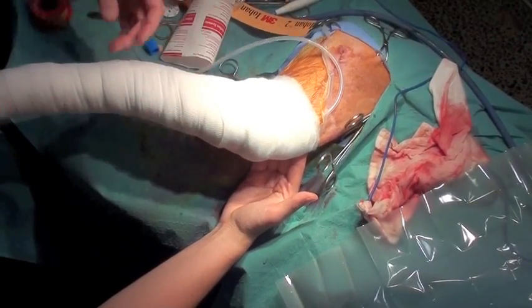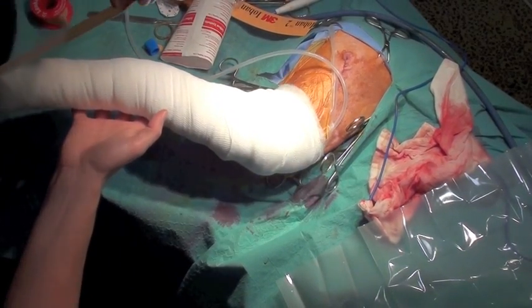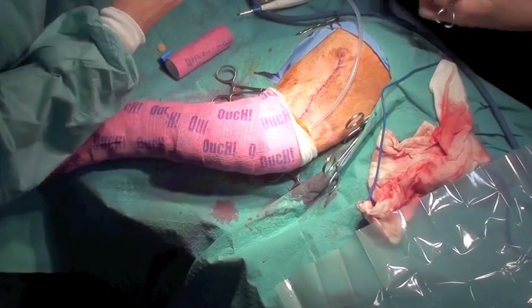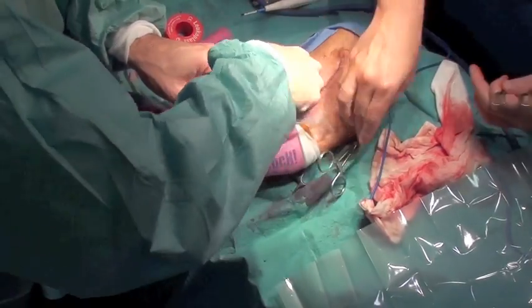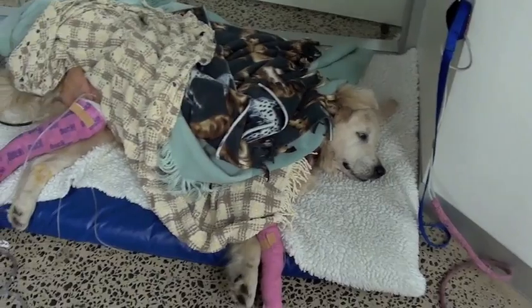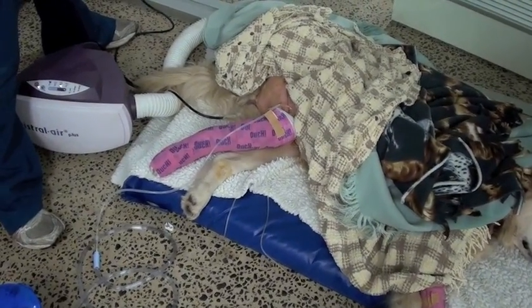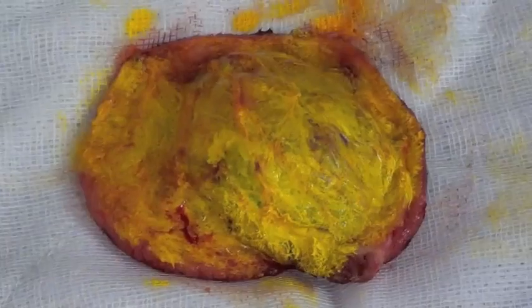The rest of a standard modified Robert Jones bandage was then placed. Here we can see the patient resting comfortably after surgery with suction applied to the vacuum assisted closure. The surgical margins were inked.